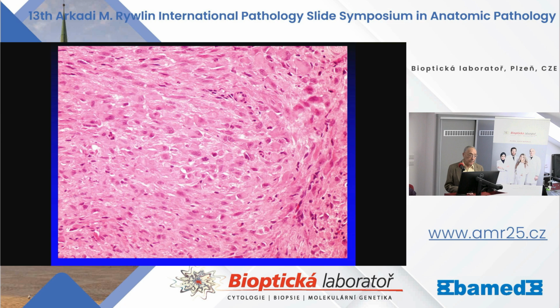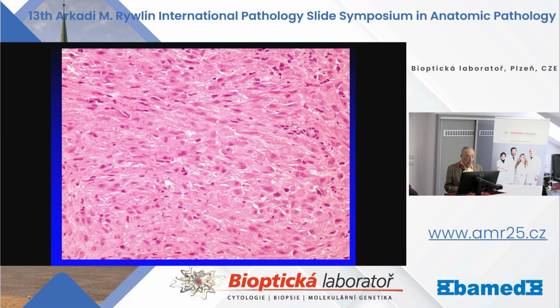Here's the histology. They look like rhabdoid cells with ample cytoplasm and atypical nuclei, which is again seen in this microphotograph.